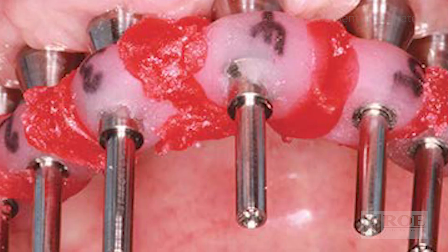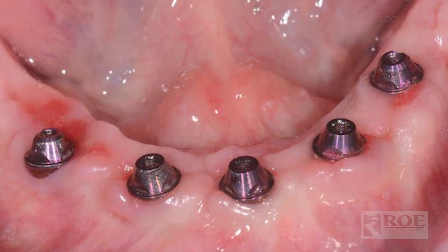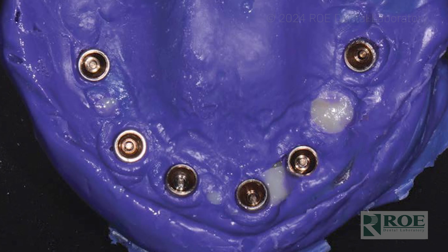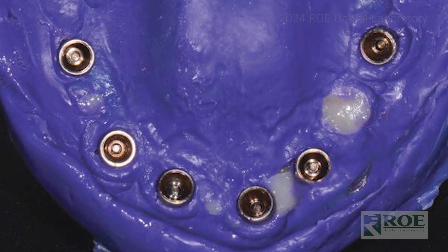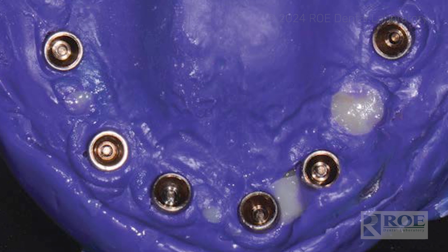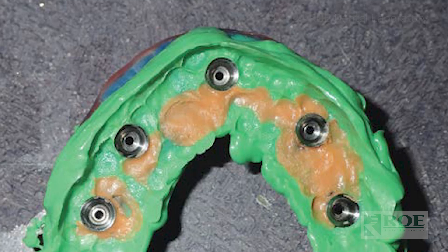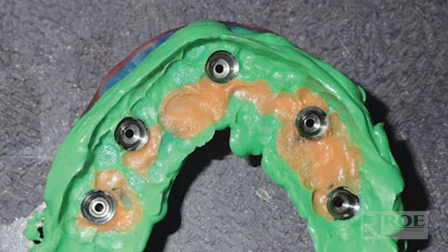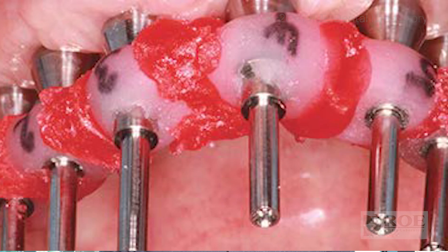So, the patient comes in, they're not wearing a denture, they have their multi-unit abutments seated, and there are probably some healing caps on there. We need to establish a vertical and we need to establish passivity of each of those implants. The first step is a multi-unit abutment level impression — open tray or closed tray, but ideally open tray is the most accurate. Send that multi-unit abutment level impression to the lab, and from there we're going to send you a fit verification jig and a screw-down bite rim.